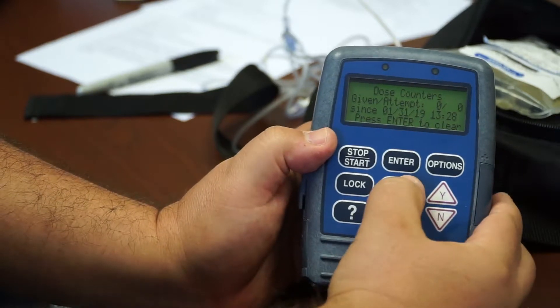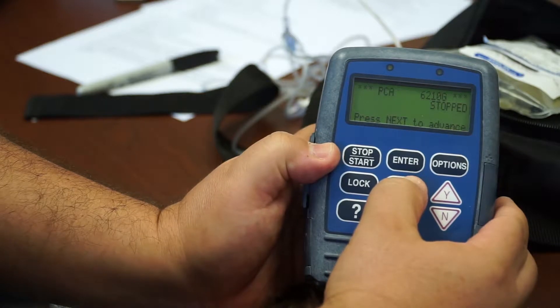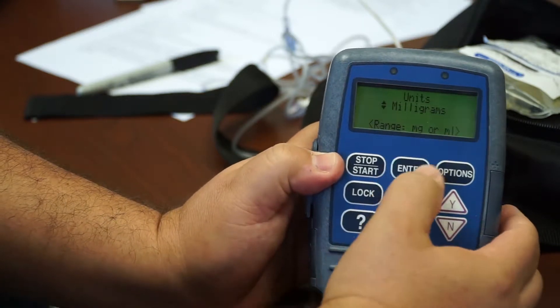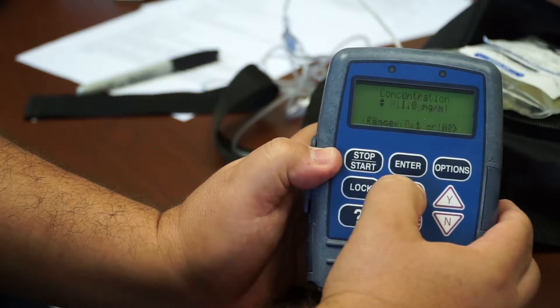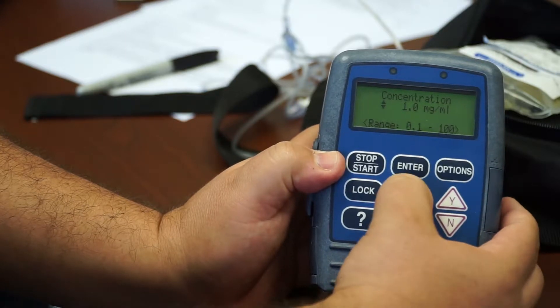And now, at every programmable data setting, it'll actually give you the options to change the lock level at the bottom. So, concentration level, I can press the up and down arrows to change the concentration.